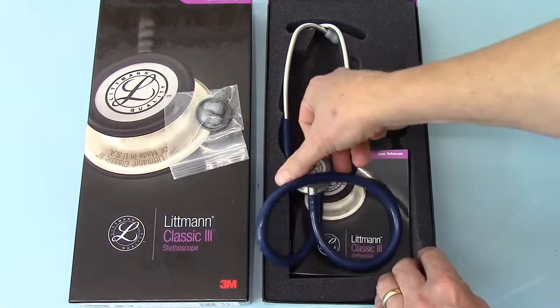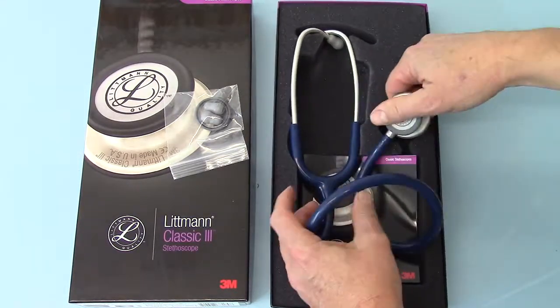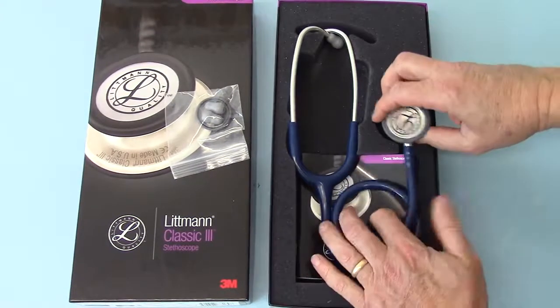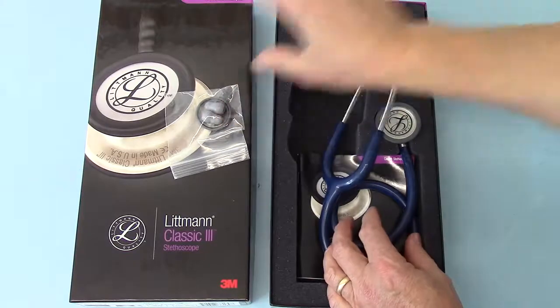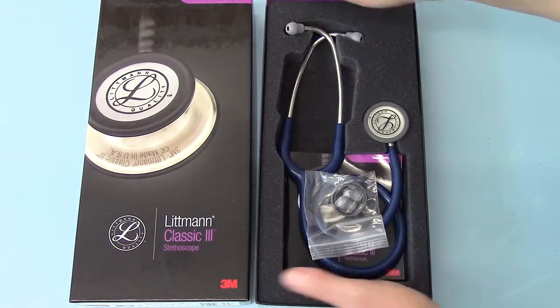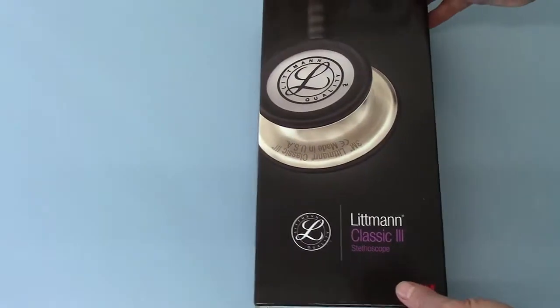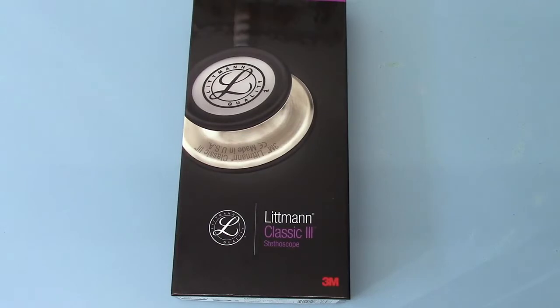So there you have it — that's what you get with the Classic 3, which is the new model from Littmann 3M. This is available from Valumed to purchase now in this colour. We also have it in black and in a raspberry tube option. Nicely packaged, nice good quality unit. It comes with a 3M Littmann warranty for UK sales, which basically protects your purchase for 5 years for parts and workmanship.